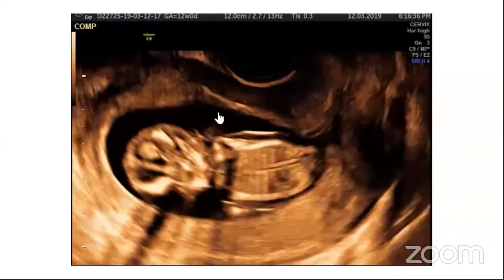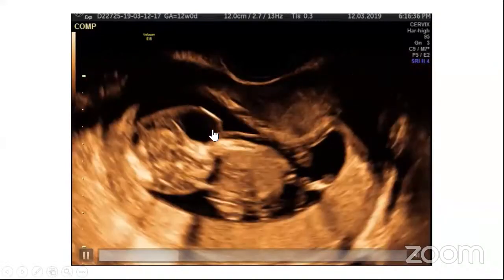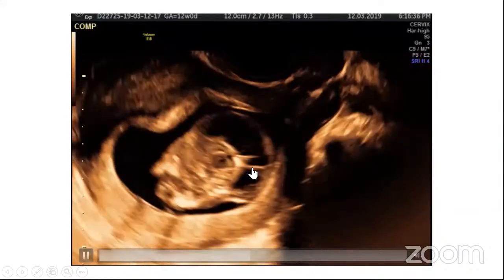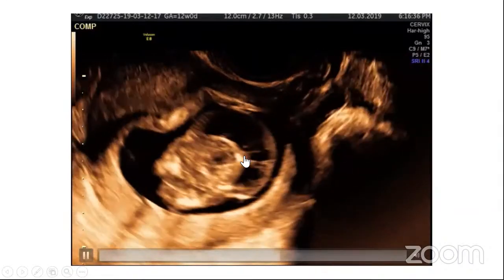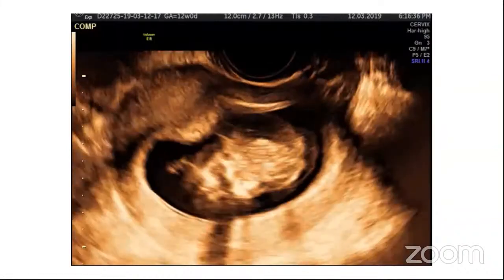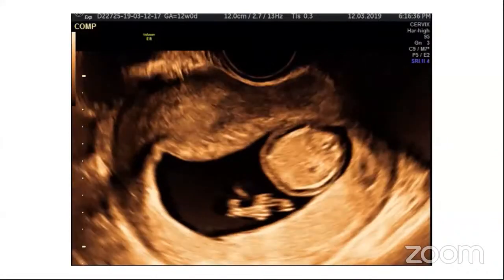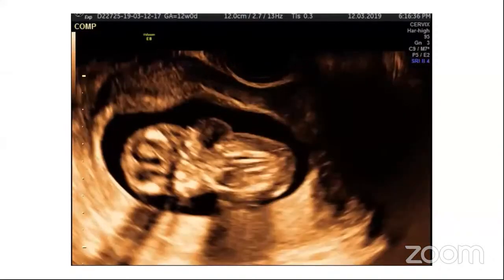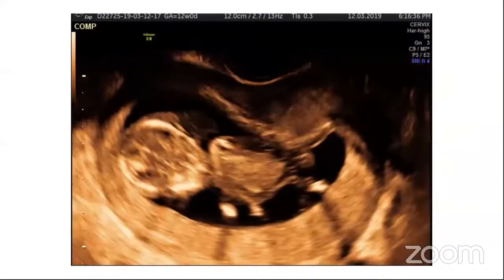In this fetus, we can see the hypoechoic septate bulges in the neck. So that was cystic hygroma. We can even see the septations and the nuchal ligament, which is diagnostic of cystic hygroma. And as we scroll down through the body, we can see there is gross subcutaneous edema all over the body of the fetus. So this was cystic hygroma progressing to fetal hydrops.